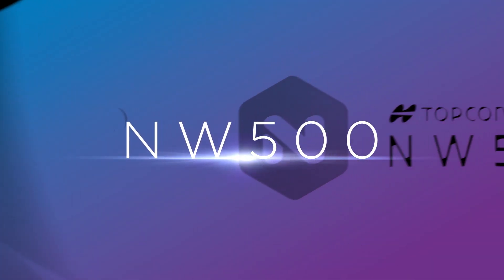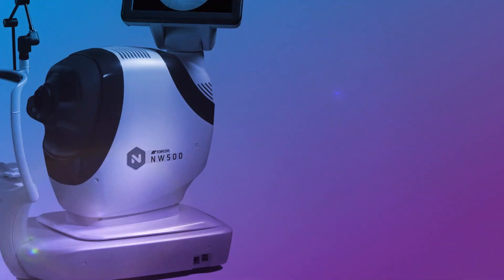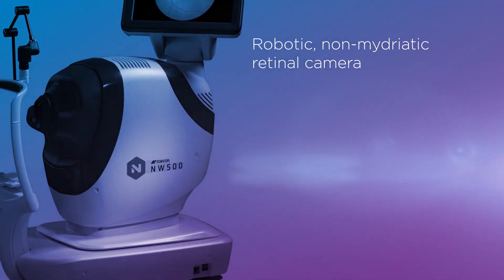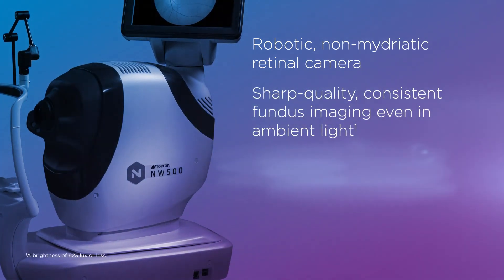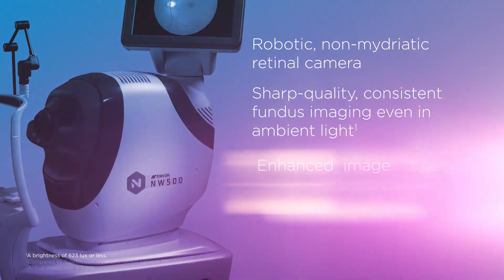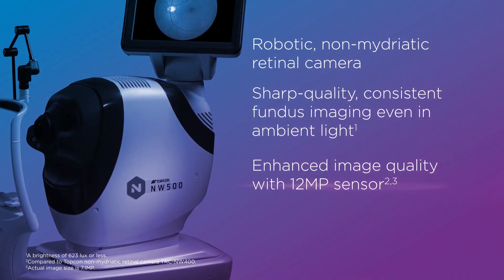Introducing the NW500. The NW500 is a robotic non-midriatic retinal camera offering sharp quality, consistent fundus imaging even in ambient light, and enhanced image quality with a 12 megapixel sensor.